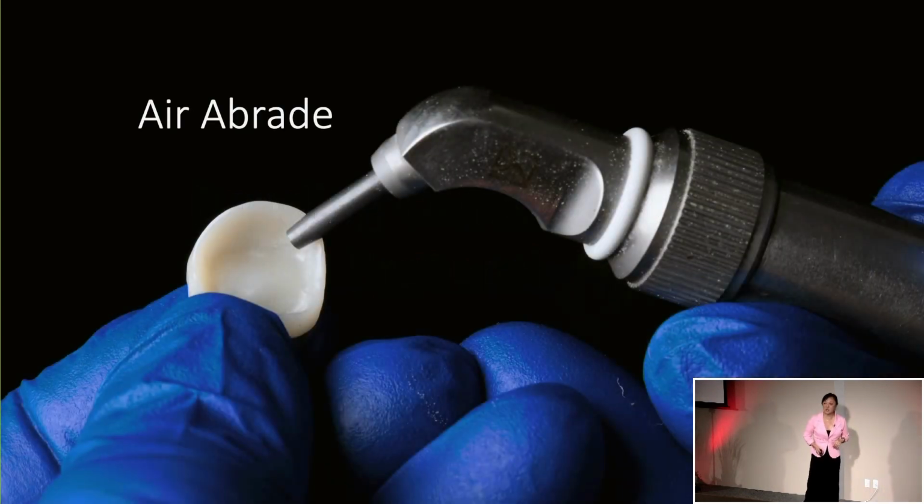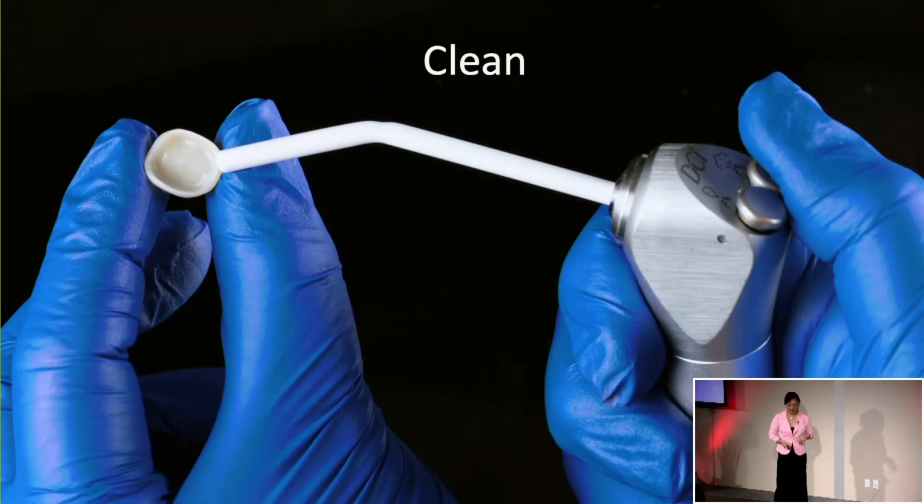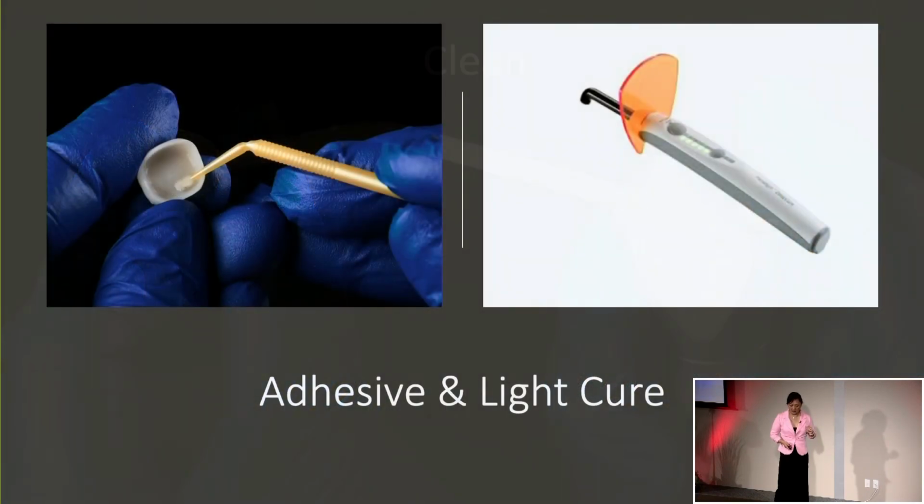So I'm going to quickly go over the bonding cementation protocol. Air abrasion, when you're milling in the office, air abrasion is very critical. You want to create that micromechanical retention that's going to occur with the restoration to the cement. Make sure that you clean it, make sure all the debris is out, and then you're going to use an adhesive inside the intaglio of the restoration, and then make sure it's super thin and light cure.